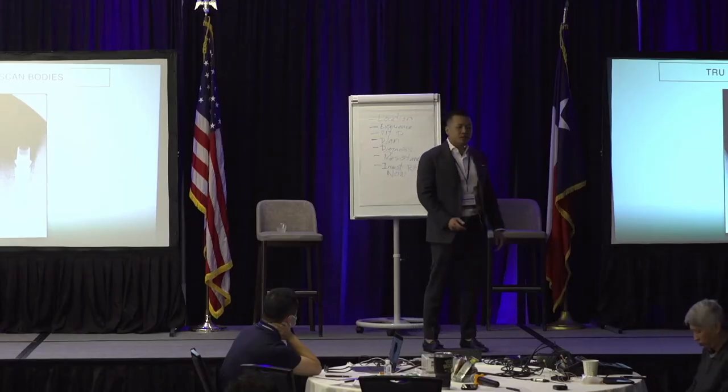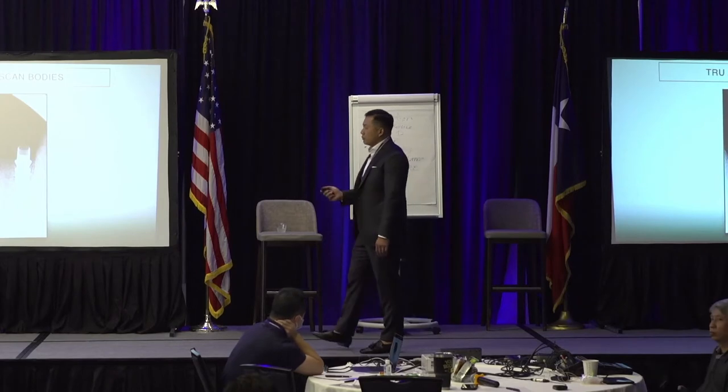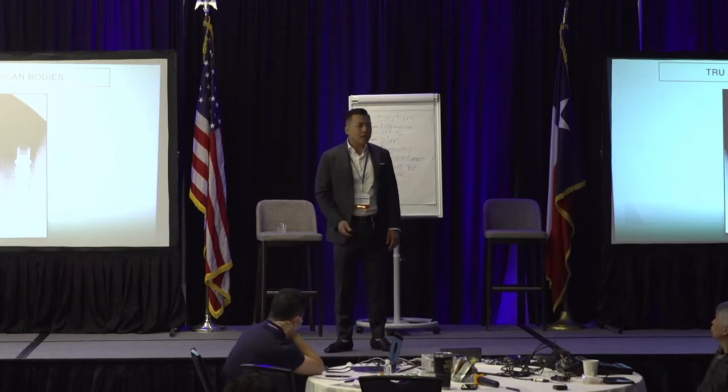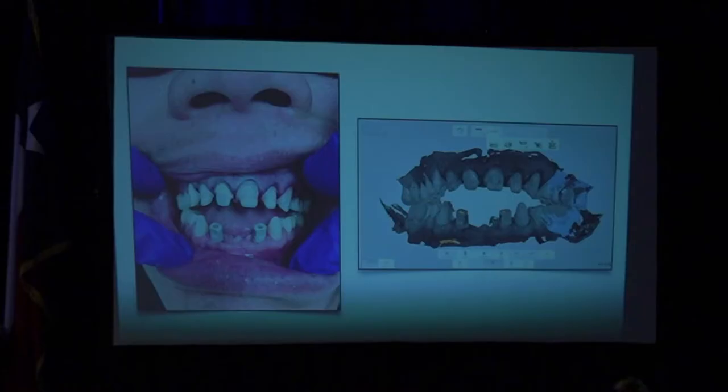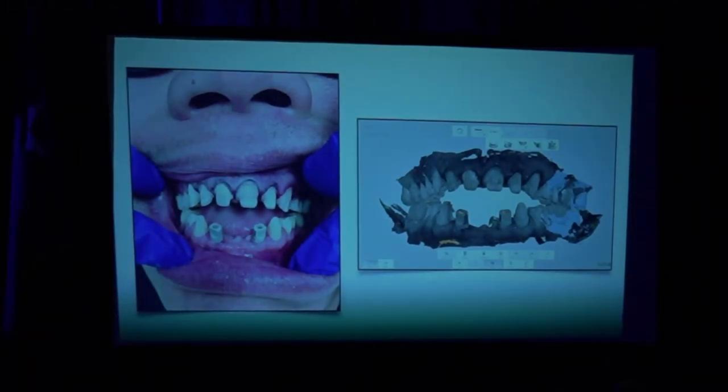And we did a fully digital workflow. Waited about 6 months for that to heal. Put on true abutment scan bodies. And what I added to this case is that Dr. Hornbrook was doing a digital smile design. I'm going to show that next, but this is a fully digital process, and I've been doing this since 2017 is when I got my first 3Shape scanner.